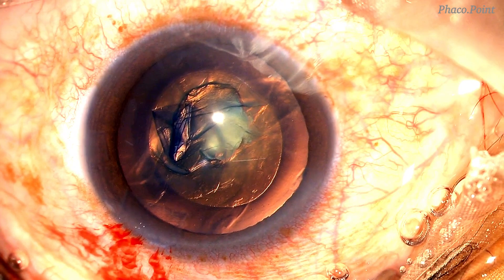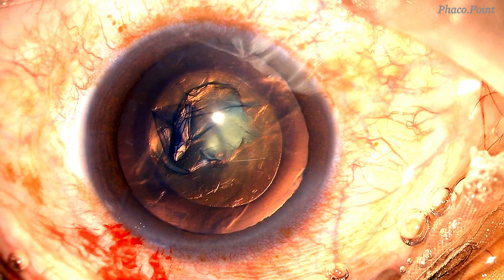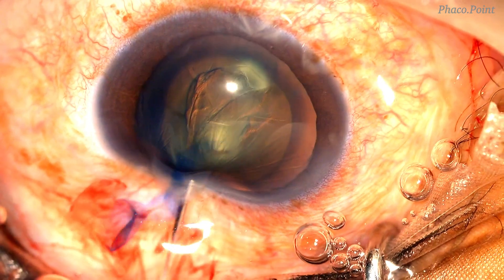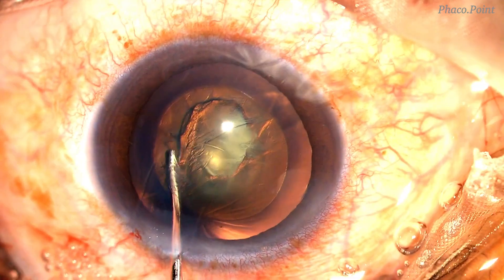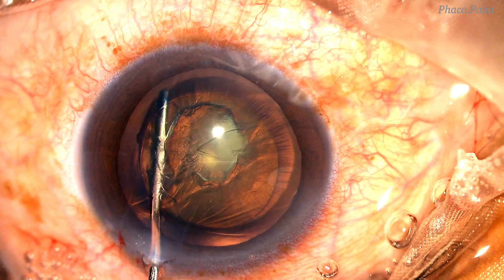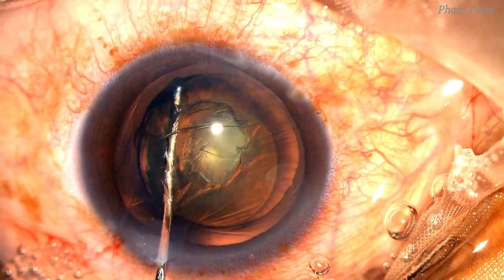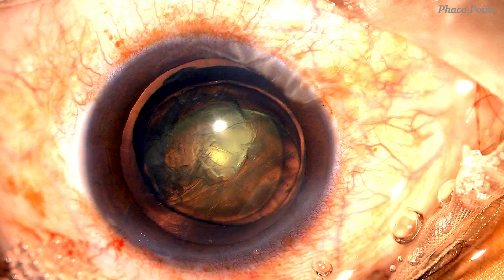The next step is hydro-delineation. We need to be extremely careful that we don't accidentally inject fluid in the subcapsular plane. As you can see, the needle is introduced well within the nucleus and a jet of fluid is injected, thereby creating an endonucleus.